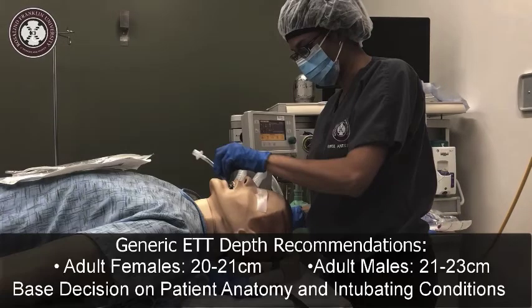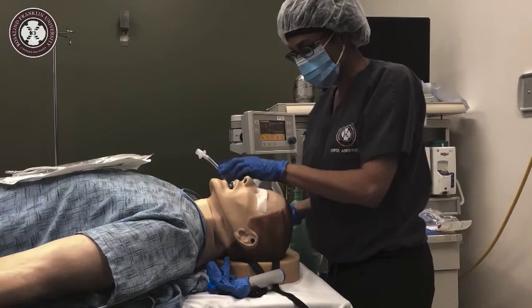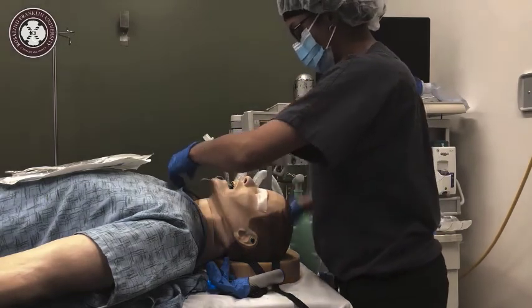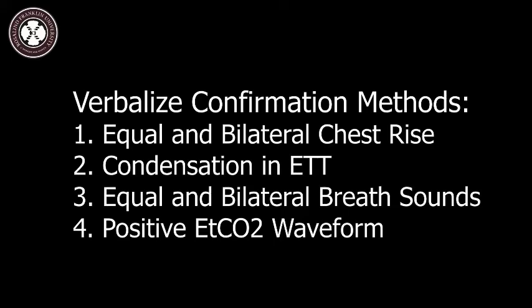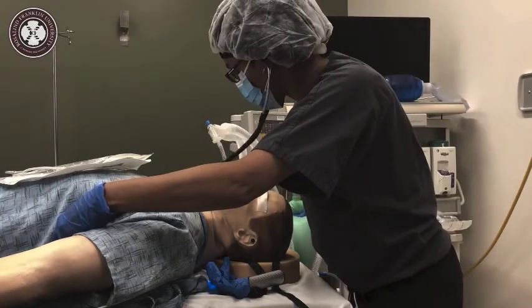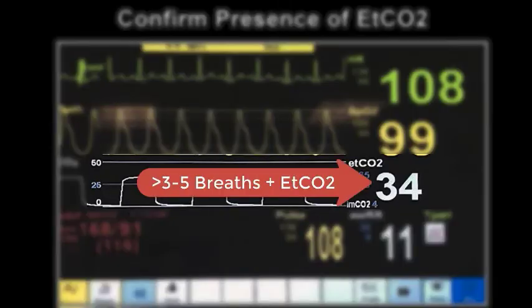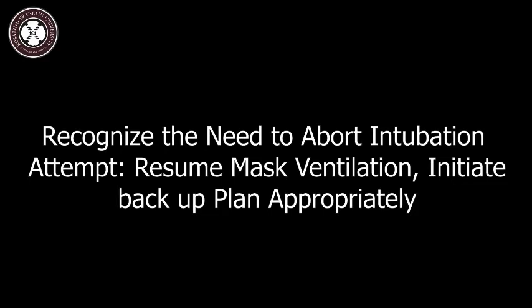Here's a list of generic guidelines for ETT depth — the final decision should be based on what's best for the individual patient. Next, inflate the pilot balloon, then connect the endotracheal tube to the circuit. Once that's completed, proceed to confirm proper placement. Confirmation methods are listed here and must be verbalized. They include equal and bilateral chest movement, condensation inside the ETT, equal and bilateral breath sounds, and adequate and consistent end-tidal CO2 tracing present for greater than three to five breaths. If the intubation was not successful, recognizing the need to forego the attempt and resume mask ventilation is also a crucial step.